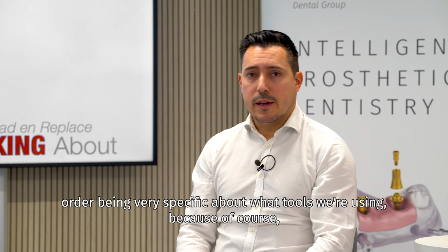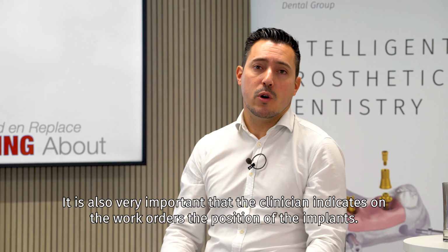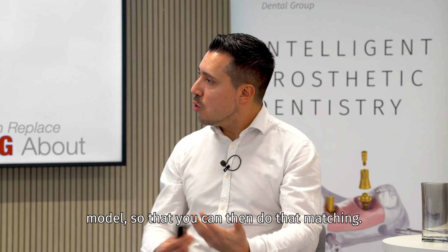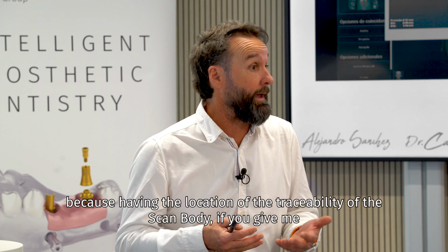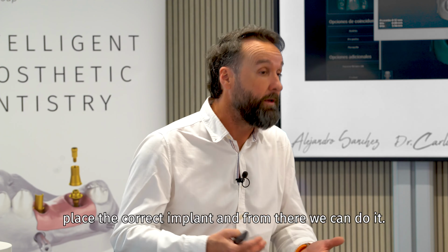I don't know how you feel about the work order being very specific about what tools we're using, because of course, if we have a compendium, we have a mix of implants placed in the mouth. It is also very important that the clinician indicates on the work order the position of the implants: I have used such a brand and such a scan body for such a model, so that you can then do that matching. This has changed so much that now the laboratory needs the traceability of the scan body that you have used rather than the implant. Because having the traceability of the scan body, if you give me a reference, it will directly place the correct implant, and from there we can work.